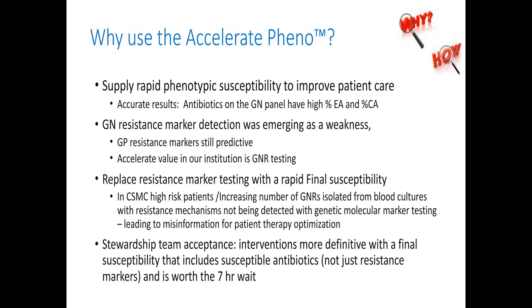So if we have to make an argument to administration for increasing staff, that could be very, very difficult. So I need to show data that the equipment can be used for existing staff, of course, if that is true. So hopefully with all this information and collaborating with others, we can make a valid business plan and get an instrument like this implemented even in my hospital, Cedars Sinai.